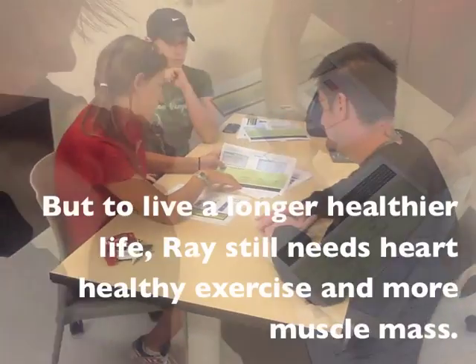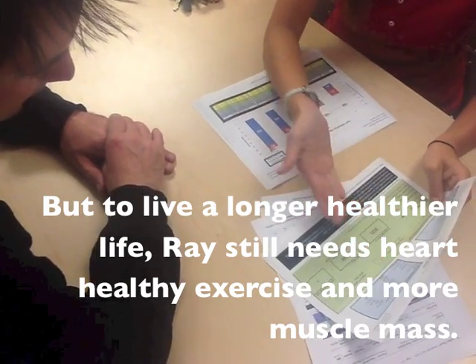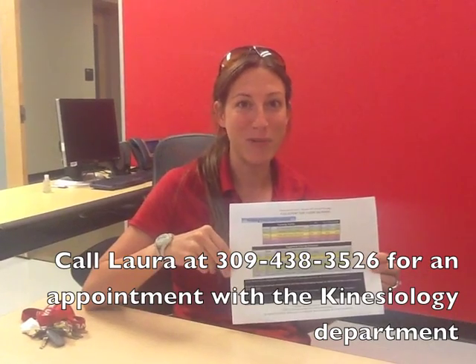Looking at the percentages, you're 84.5% lean and 15.5% fat, which is good — that puts you in a healthy category. My name is Laura Wheatley at the ISU Exercise Physiology Lab. Come visit us and we can make a report just like this for you during your visit. You can visit us on our website.